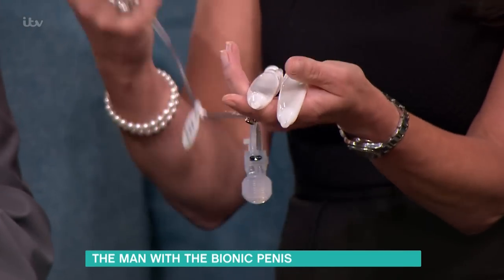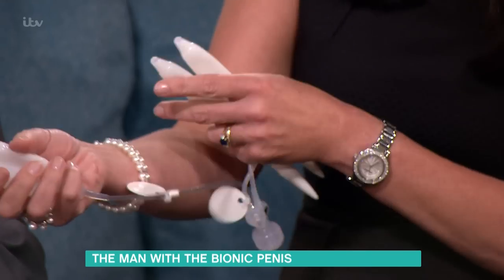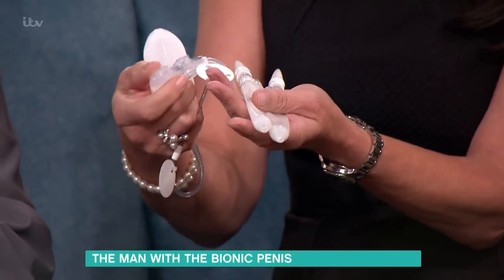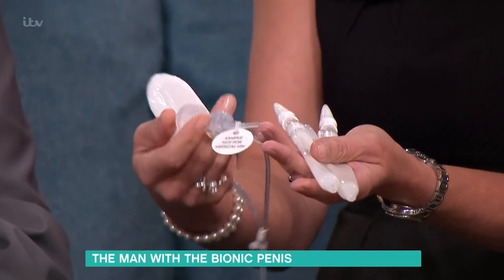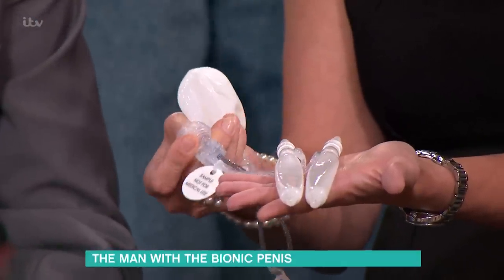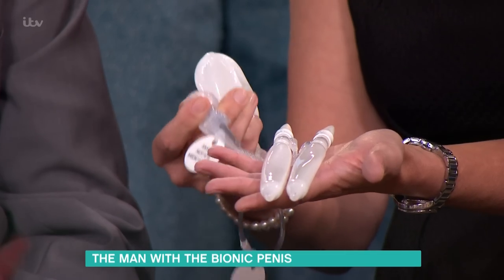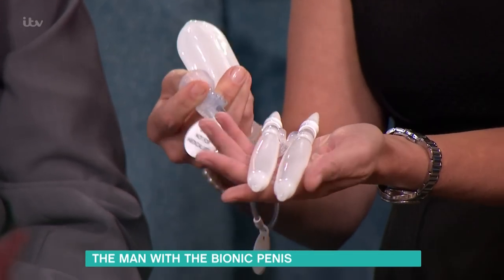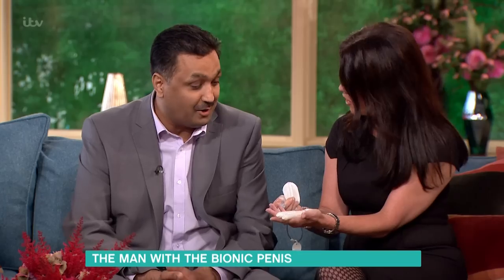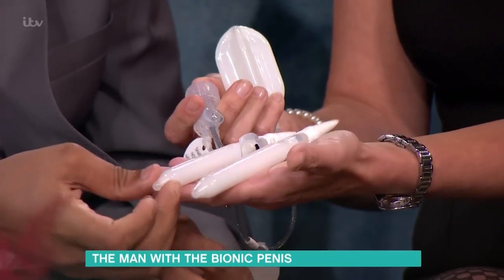That's the reservoir, and it sits underneath the skin in his abdomen. These chambers lie in the penis, which has been reconstructed from skin in his forearm. This little part sits next to the testicle in the scrotal sack — Mo can just push that, press it a few times, and water from the reservoir goes down the tube. It really does become very firm — you can see it's quite solid.